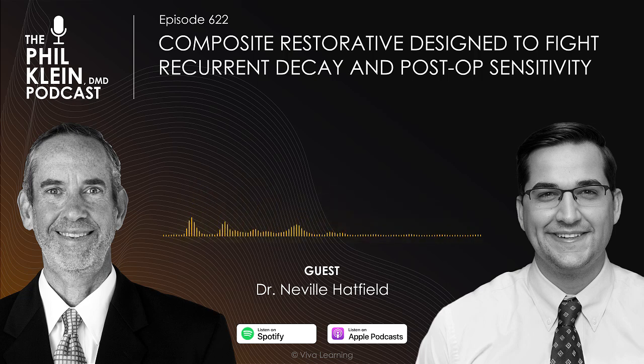And if you would, Dr. Hatfield, just briefly mention the factors of whether the restorative material that you're putting on is either self-cure or light cure, and how that influences your decision on what bonding agent to use. Well, there's a self-cure material in composite dentistry, and there's a light cure. Most of our composite resins that we use nowadays are light cure. There's some kind of activator that would cause it to be activated.